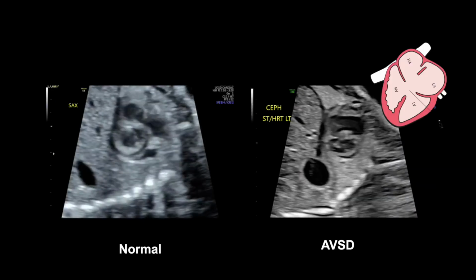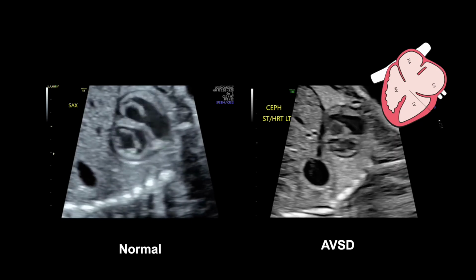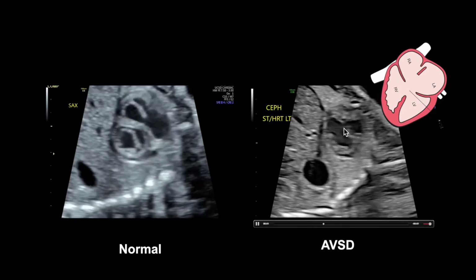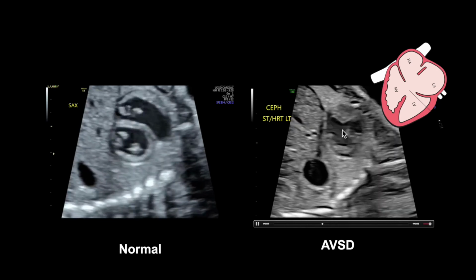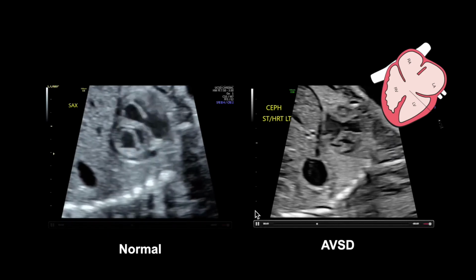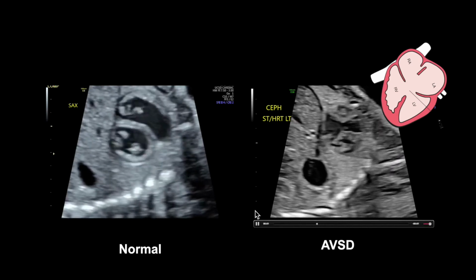If we look at these hearts in the transverse or in the short axis plane, this is a really nice way to look at that single AV valve and prove that it is a single AV valve. So when we look here, we can see really nicely that we have a common atrioventricular valve as opposed to our normal 2 valves. So this is an essential view in context of looking at these valves.